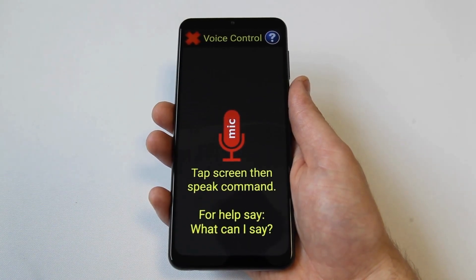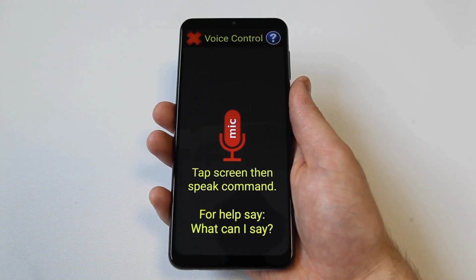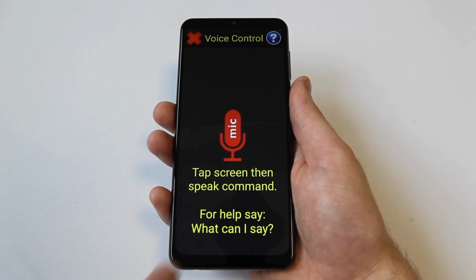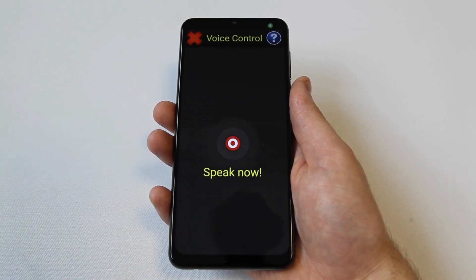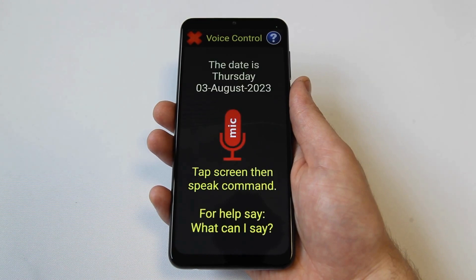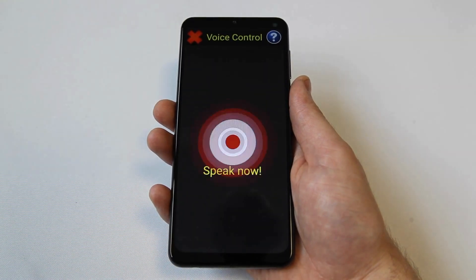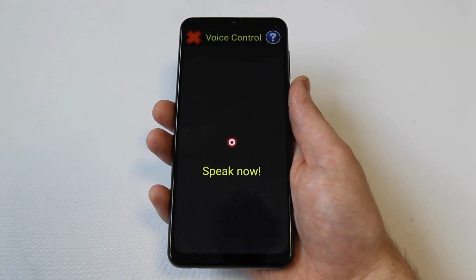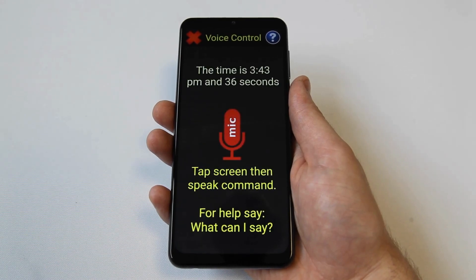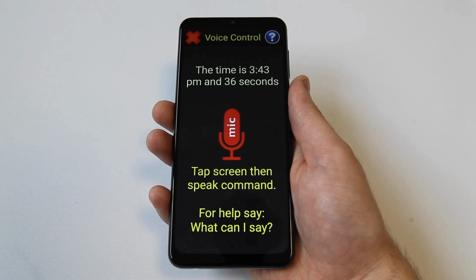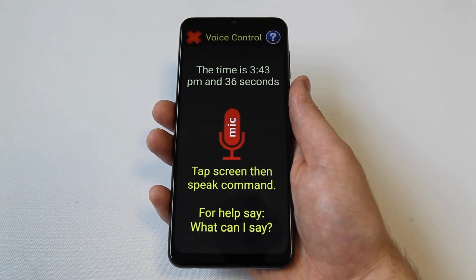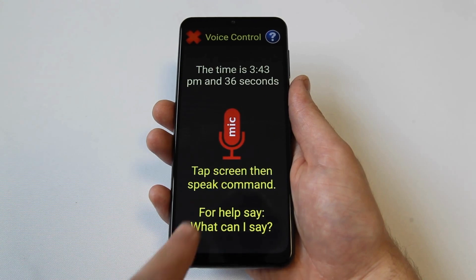Fourthly, obtain information about your device using voice control. Simply say what's the date to get the current date. What's the date? The date is Thursday the 3rd of August 2023. Or say what's the time to get the current time. What's the time? The time is 3:43pm and 36 seconds. Also, enquire about your phone's battery charge by saying battery. This will announce your current battery level.